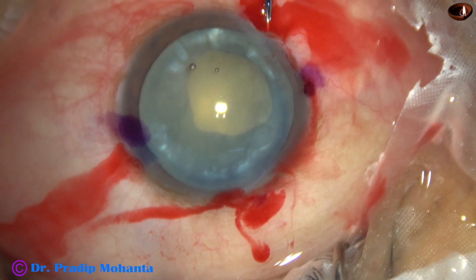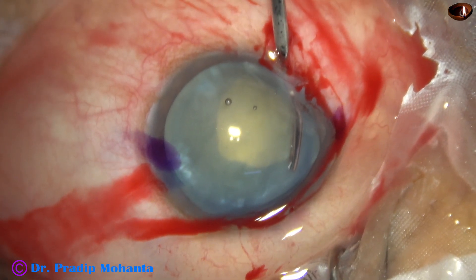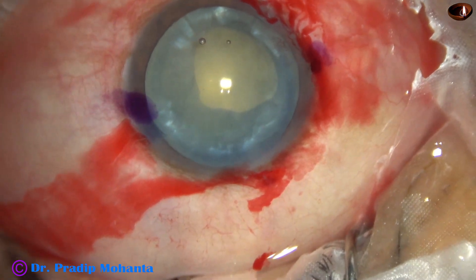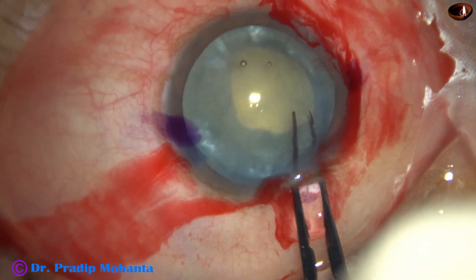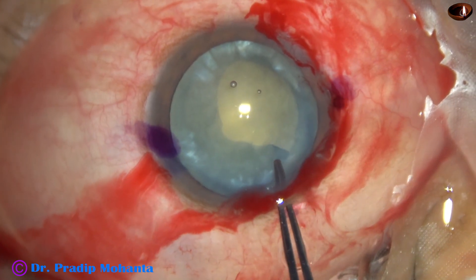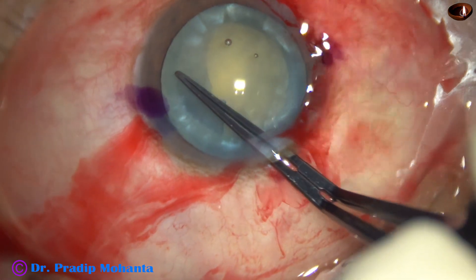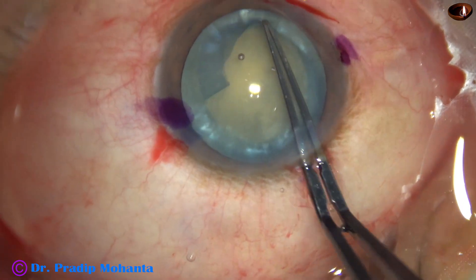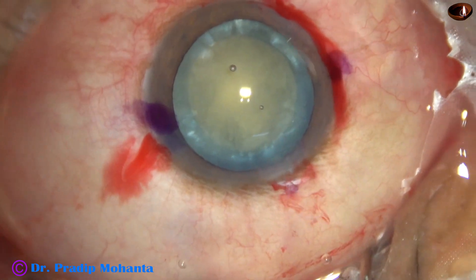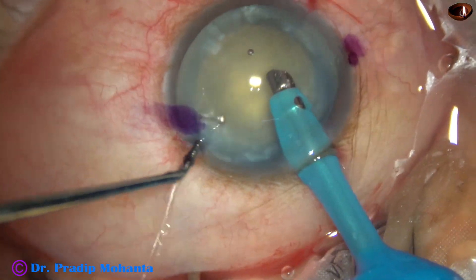Now I inject visco and then use the side port at 7 o'clock to make a cut at 9 o'clock. I go clockwise from here and do the rhexis. Usually I go anti-clockwise, but in this case I have no other option — I have to go clockwise. But see how controlled the movement is — it has become a nice rhexis.